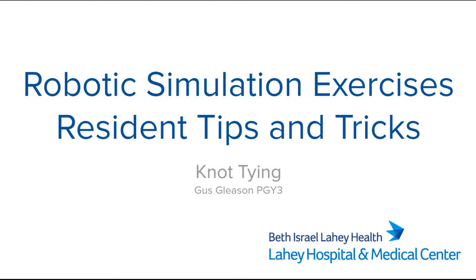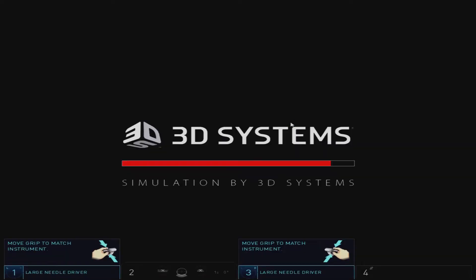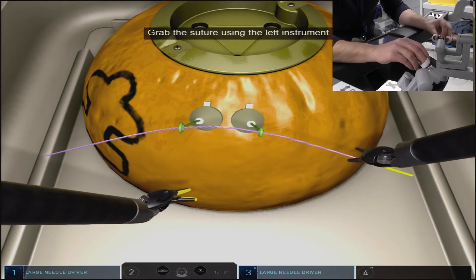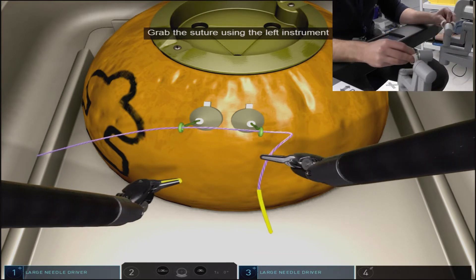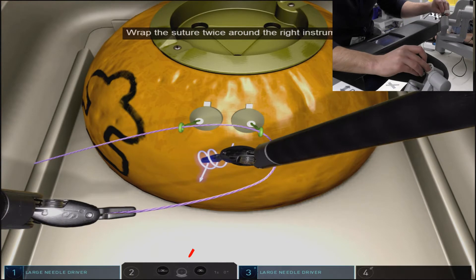This exercise is knot tying. It is designed to teach users how to do a surgeon's knot followed by two additional throws in the instrument tie fashion using the robotic arms. First step is to grab the end of the tie on screen right with the left arm. Initiate your double loop surgeon's knot at the wrist junction. This will prevent slippage of the loops in this exercise.